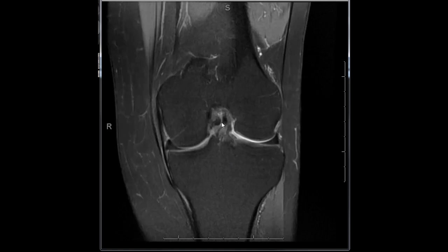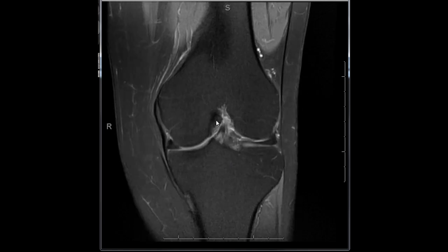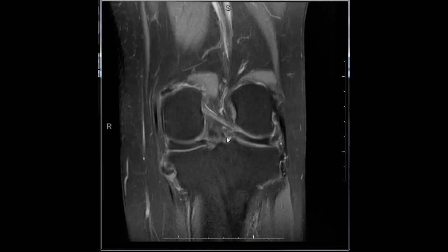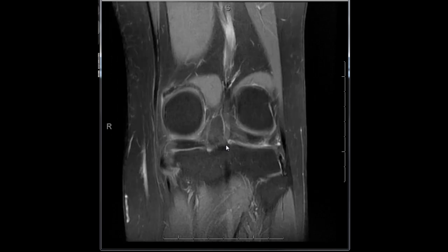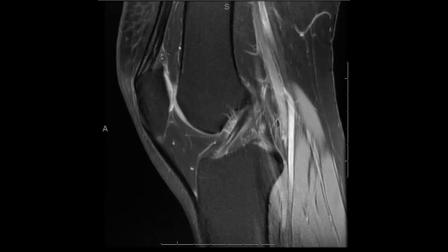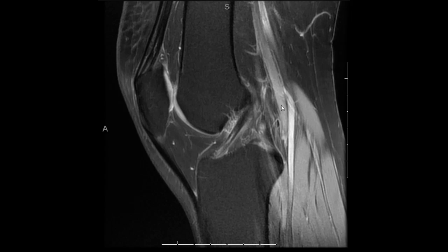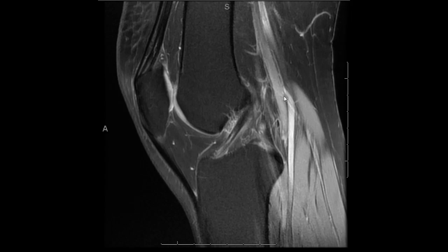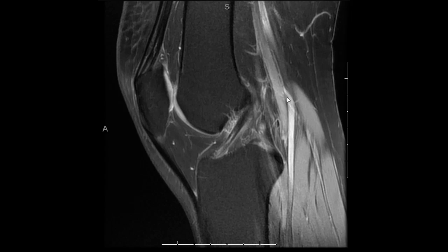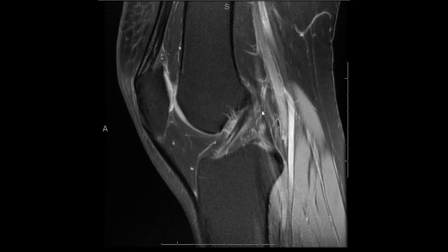The PCL, or posterior cruciate ligament, begins in the medial femoral condyle and inserts posteriorly on the tibia. As I said, looking at the sagittal image, the cruciate ligaments — and all ligaments, actually — should be evaluated in all planes if possible.